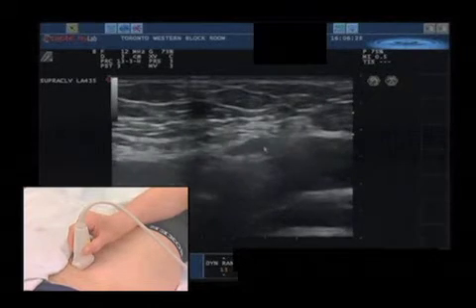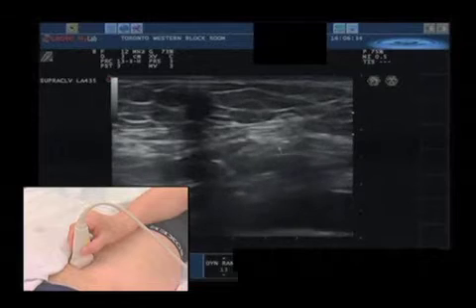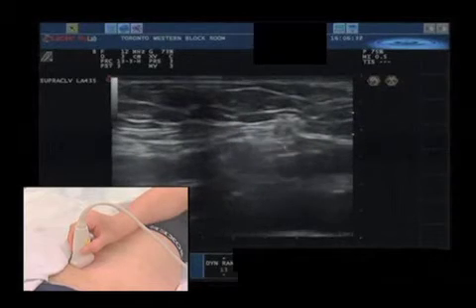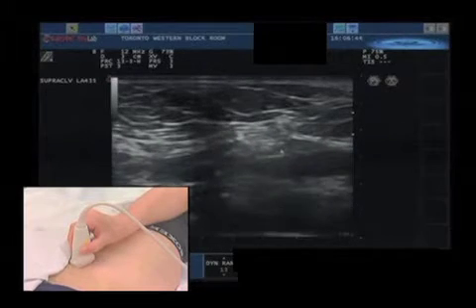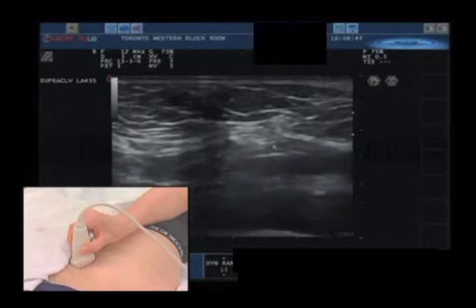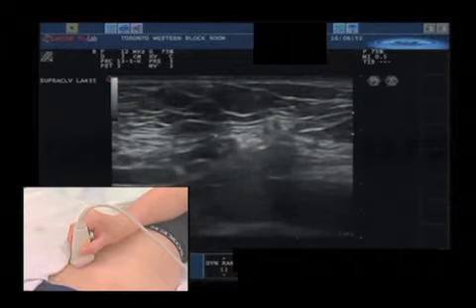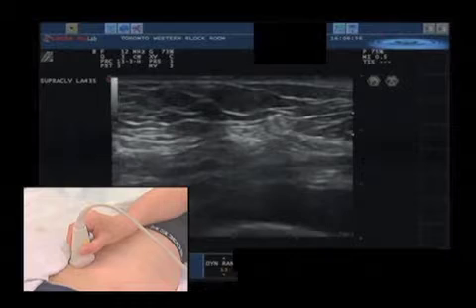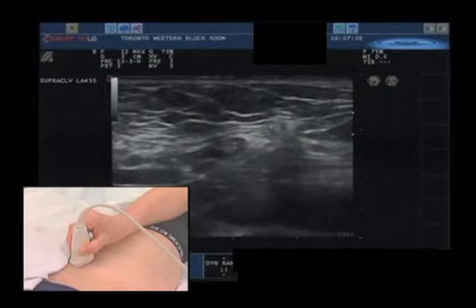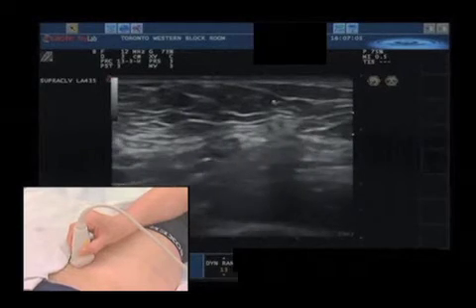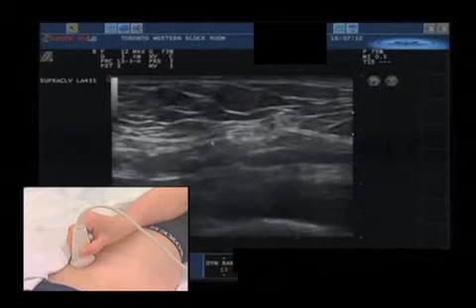Very close to that, we find a point by shifting the transducer medially where the spermatic cord is nicely seen. We are also concentrating on the borders of the inguinal canal. These borders include a very bright reflex, possible to follow cranially — this is the aponeurosis of the external oblique abdominal muscle, which we have to go through for the inguinal canal block. On the cranial side, you see a darker area, which is the inferior border of the transversus abdominis muscle.